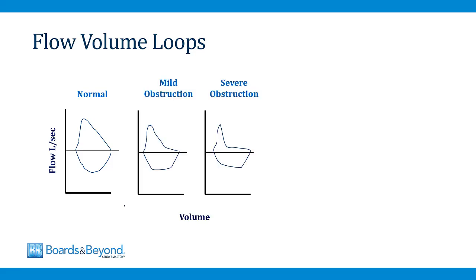And first, we'll talk about obstructive disease. So when patients exhale, initially there's a very fast flow rate as patients blow out, but then the flow rate starts to taper off. And this portion here where it's tapering off is highly dependent on flow of air through the bronchioles and bronchi. And if there is obstruction, that portion will become abnormal. So this portion begins to have an indentation in patients with obstructive disease, and the indentation gets more severe depending on the obstruction. And this shape is the shape that you need to know to understand obstructive lung diseases and flow volume loops.